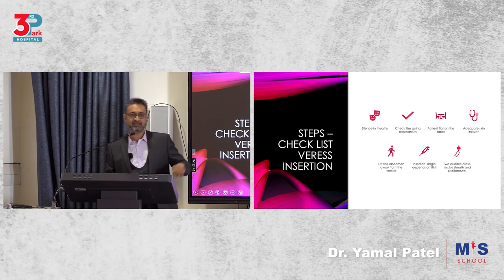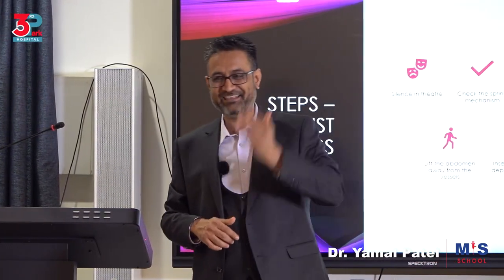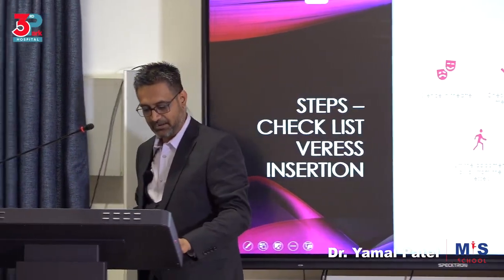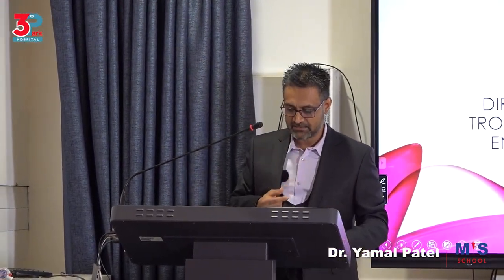What do you do after that? Start rotating around? No, please never do that. If you have gone into a vessel or bowel, it's like a needle and nothing will happen. But when you rotate it, you're making that small hole into a laceration, and now you have a problem. So you do your safety tests with saline, etc., but no moving around. Safety tests are very important.